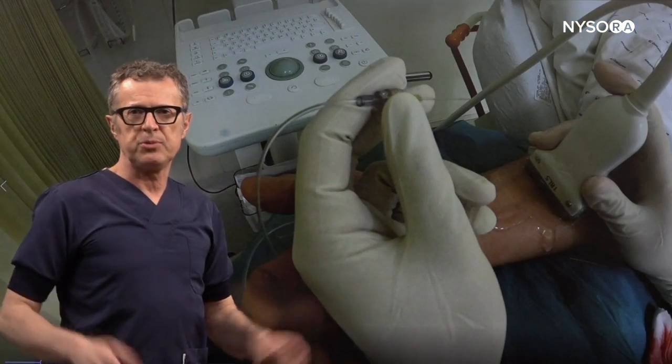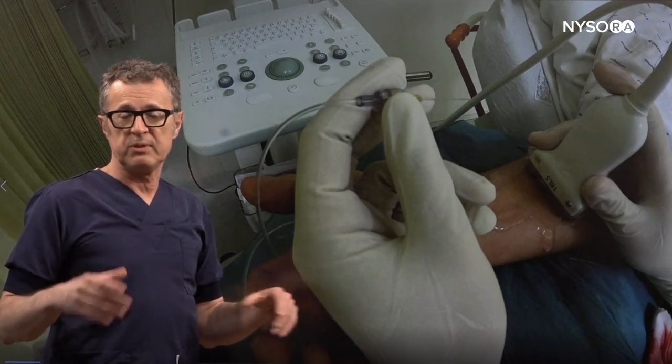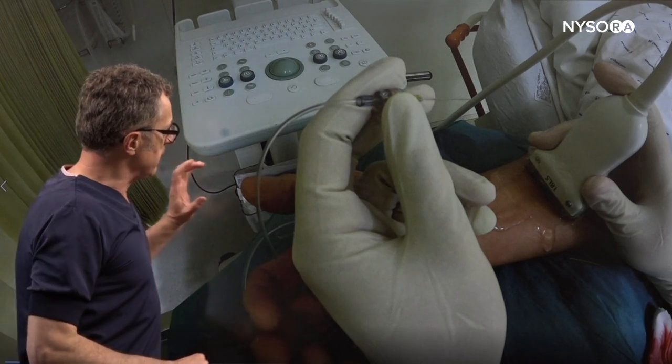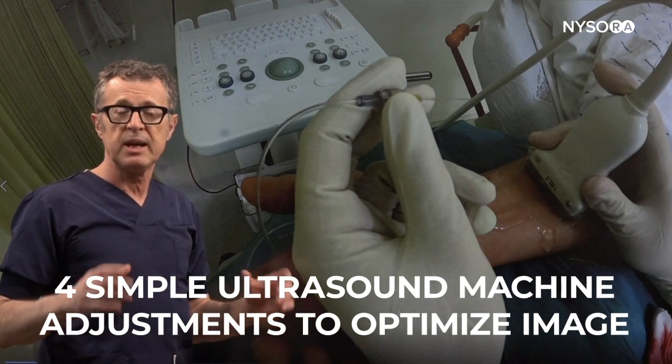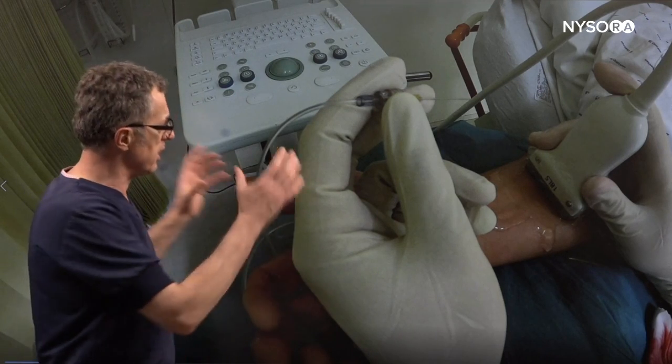Welcome back to the NYSORA YouTube channel. In this video we're going to demonstrate the performance of the median nerve block for carpal tunnel surgery, but at the same time we will use this as an excuse to demonstrate four simple ultrasound machine adjustments that can change the image to a substantially more favorable or better image for the given procedure.